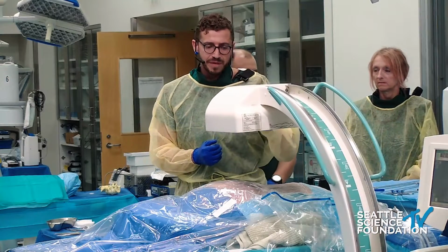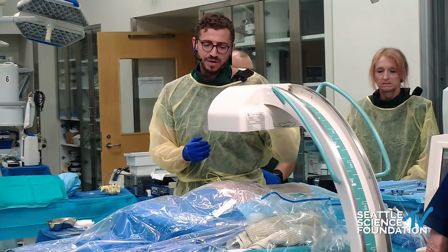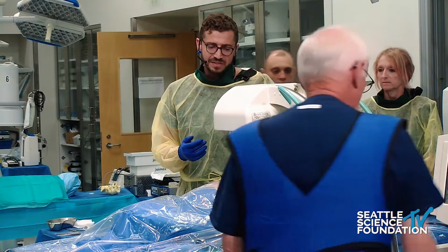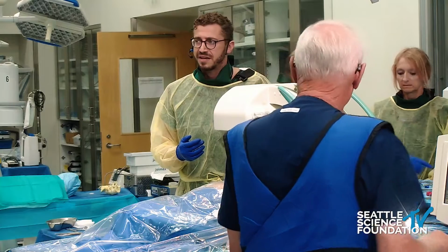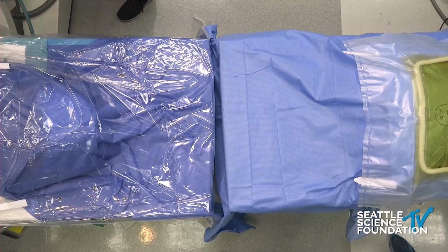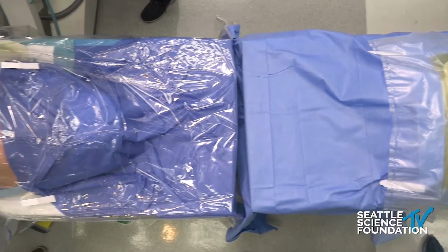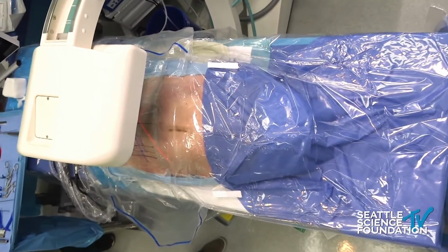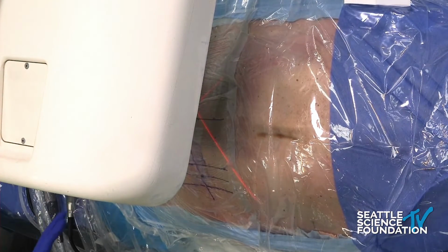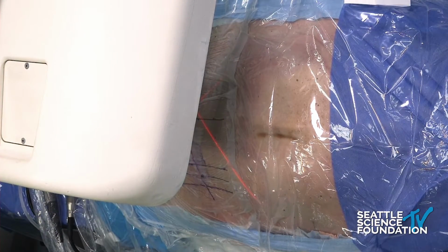So we'll get an AP first and a lateral, just to demonstrate what a perfect AP and a perfect lateral look like. We made some incisions here just to make things go faster, and we're aiming for the L3-4 disc space. So we'll show what an AP looks like here. For this donor, caudal is on my left and cranial is on my right. So if we could take an X-ray there.